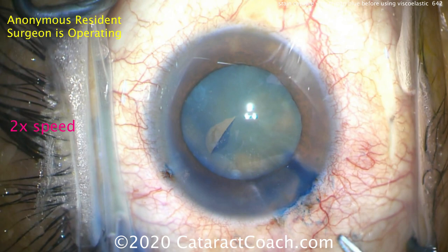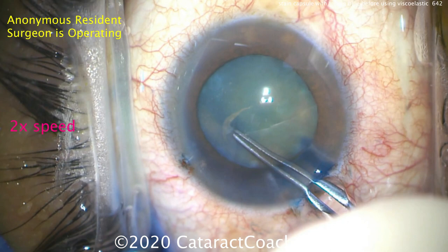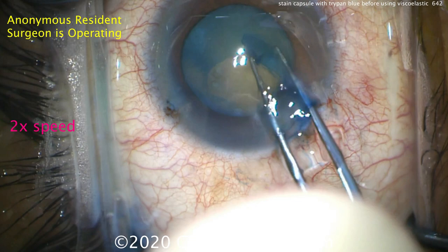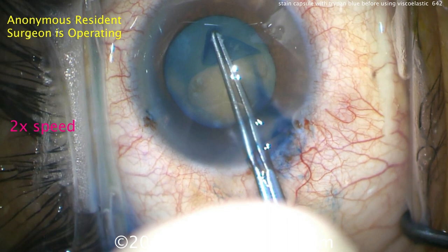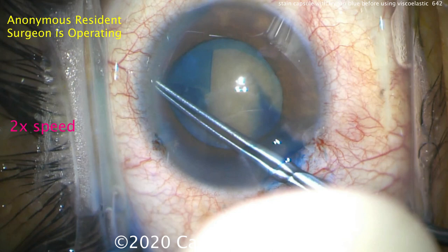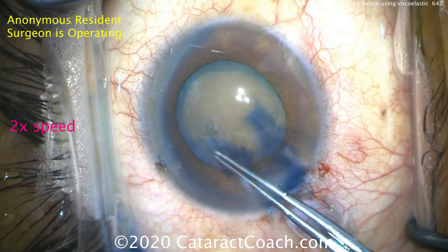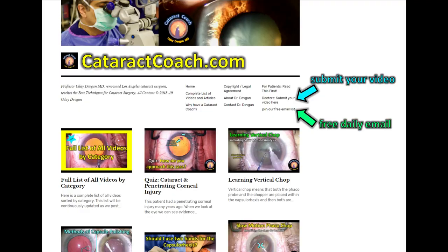We'll speed this video up a little bit. You can also see the outline of the incision there, which looks pretty good. Now the resident will grab this and let's get a good rhexis completed. Remember, in a dense cataract like this — you've heard me say it a hundred times — no baby rhexis. Make a sufficiently large capsulorhexis, at least five, if not five and a half millimeters. When you have a totally dense, opaque lens like this, you can even make a six or six and a half millimeter rhexis. If it doesn't overlap the optic, we'll forgive you.